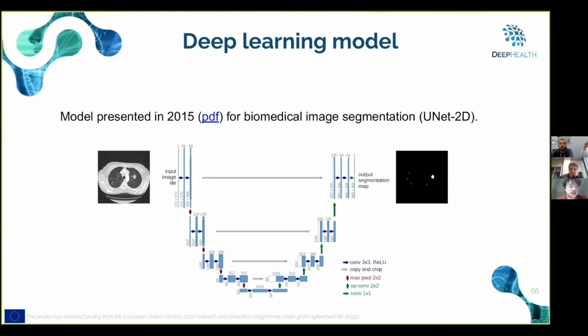In this example, we can see that UNet has an encoder and a decoder part. We use our input to decrease its size and map it into a low-dimensional embedding, and from this embedding, we upsample and produce the output segmentation map. This is one of the typical ways to do image segmentation.